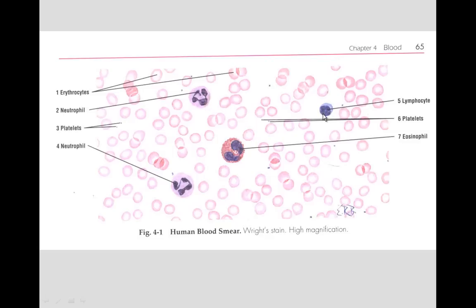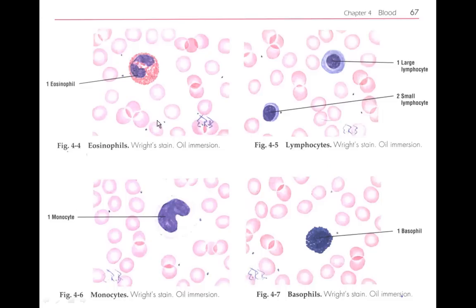Another common cell is a lymphocyte, which looks spherical with a little bit of cytoplasm around it. We also see an eosinophil, which is similar to the neutrophil except that it has eosinophilic granules.